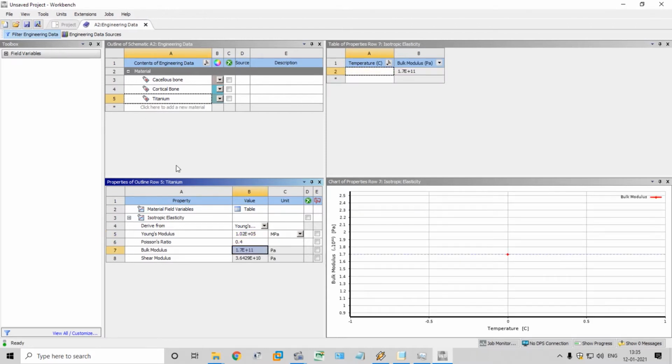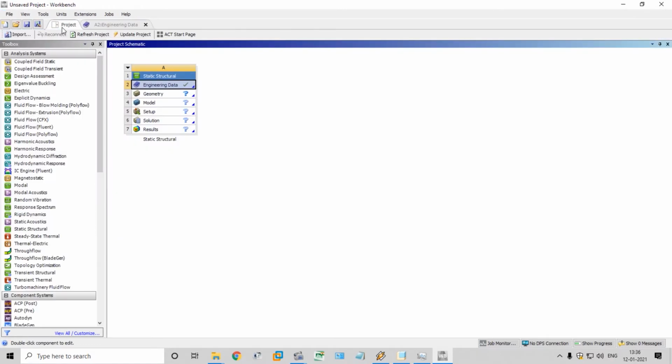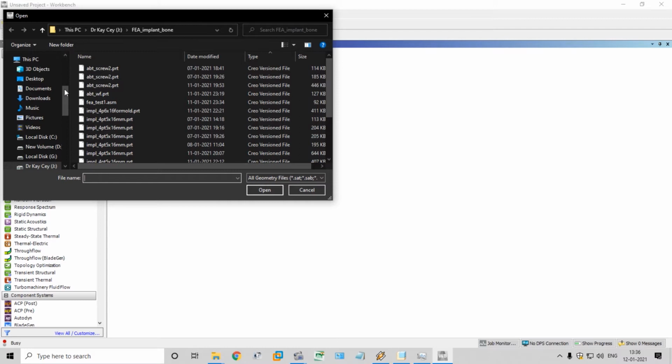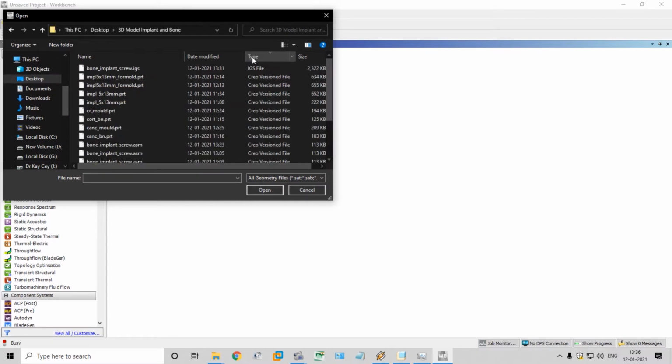So that's all. You can save this data as a separate file, export engineering data, you can use it later. Then attach the geometry, import geometry file, desktop, and then type of the file IGS. That we exported from Creo, the assembly file .IGS. Open it.